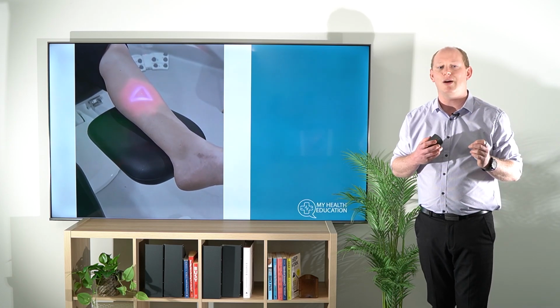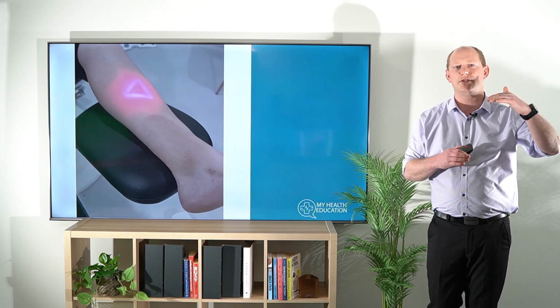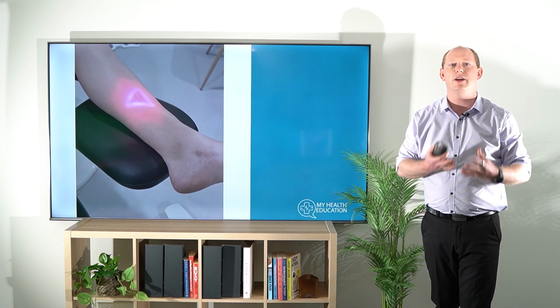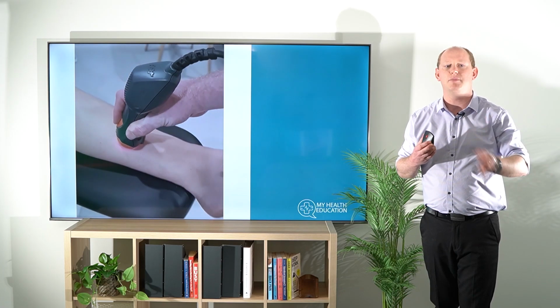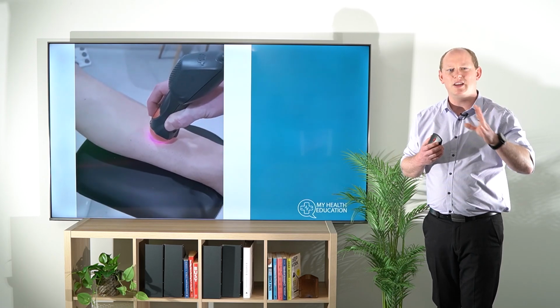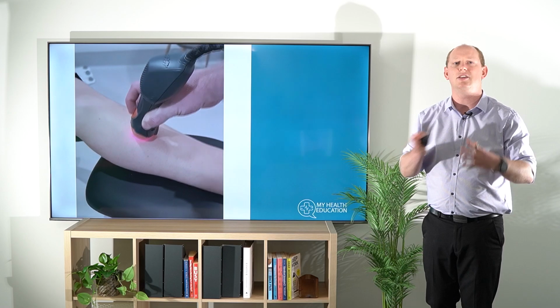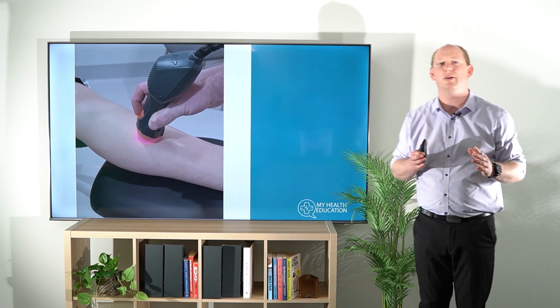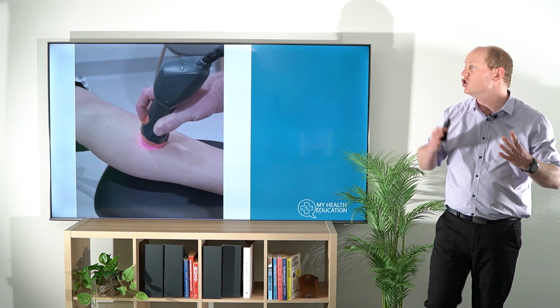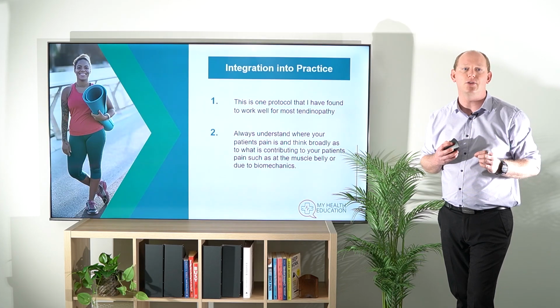Then we're going up through to our muscle belly. Do go a little bit more superior and inferior to that area to make sure that you're really freeing up everything that you can. Doing a few trigger points is going to put them in a much more comfortable position. And typically, for my device, I'll do the trigger points whilst I've got the foot going, so that I can then go through and have a bit of a feel of where those trigger points are, and then undertake them, because it's the best thing that you can do to make sure that your patients are going to get that good outcome that we're looking for.